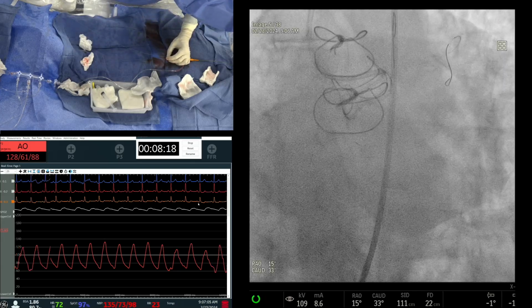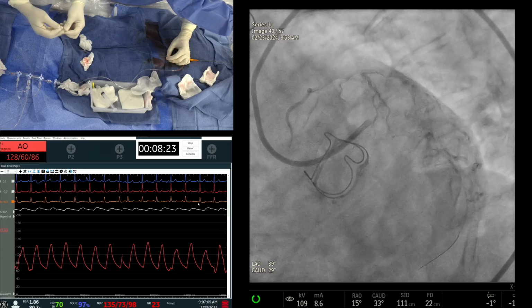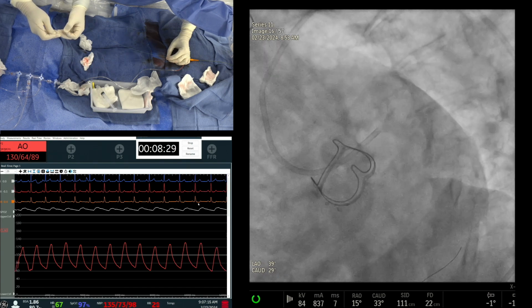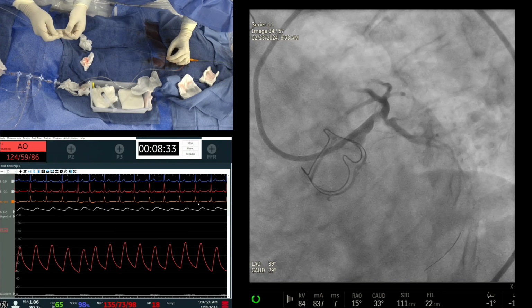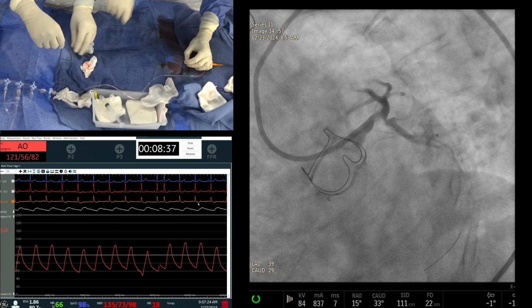You know what? And this calcific nodule are the ones that every study has shown. Those are the ones which have higher complication, particularly perforation. No, wait. Yes. Can I wire? That's fine. I know. I'm leaving it.